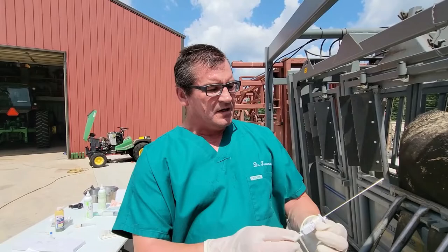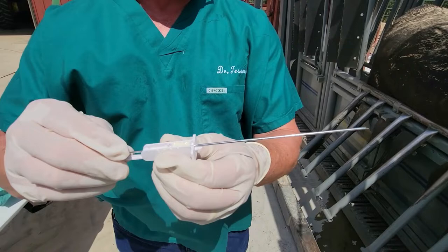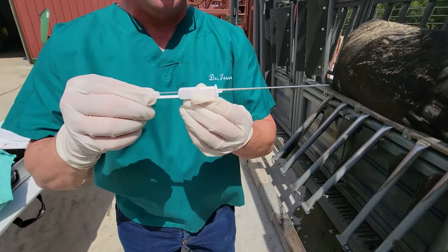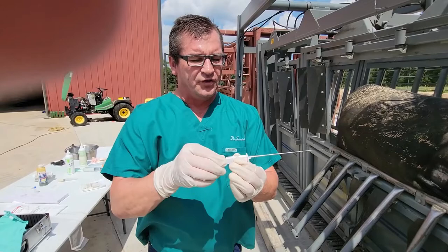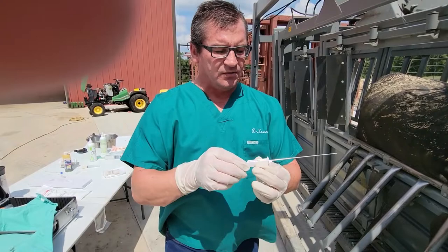The important part is that you will get the sample right in this groove here. When we capture the sample, it's important that we push forward with all of this intact together, then move the trocar — the inside part — forward. The liver will come down over that, then we hold this in place and put the outside sleeve forward. That's how we cut the sample and then pull it out.